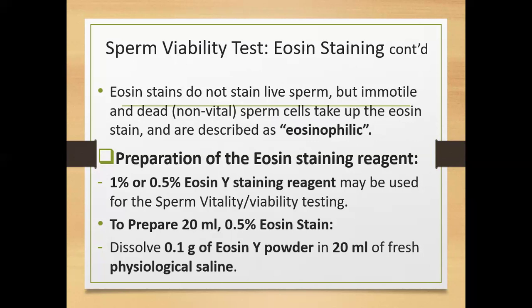Therefore, if you use the stain in ordinary water, the cells which were actually alive, the water will move into them and they will die.